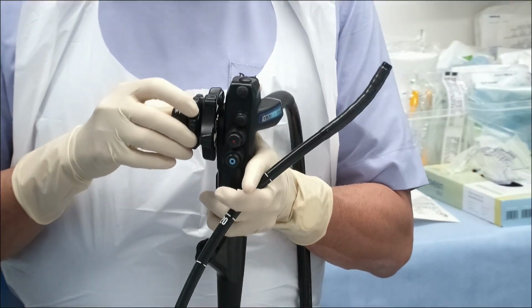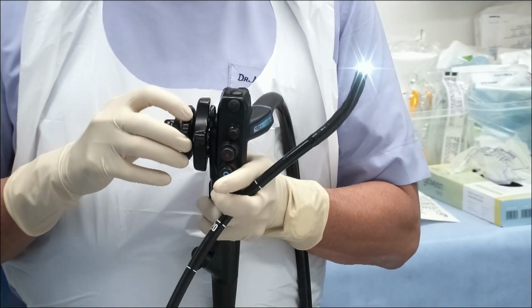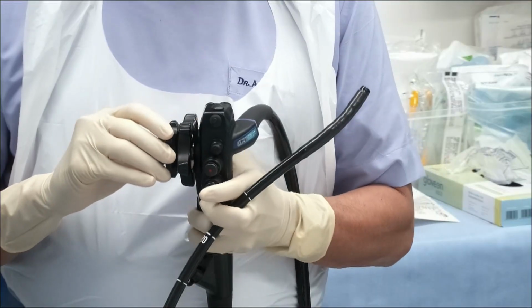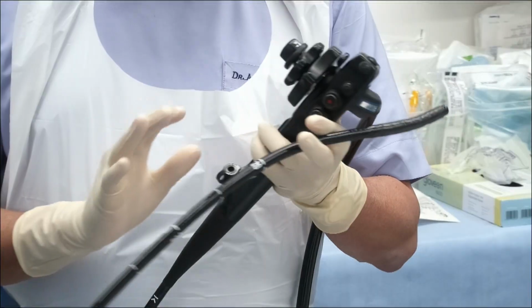So, by turning the small wheel and the big wheel, we can turn the tip of the scope in different directions. And as you see here, you can rotate the scope a complete 360 degrees by turning a combination of the small and the big wheel. So, you see these are the parts of the scope.